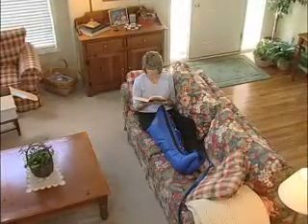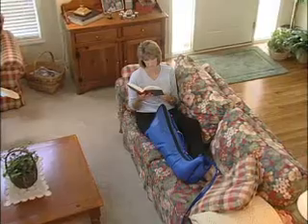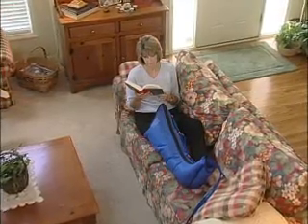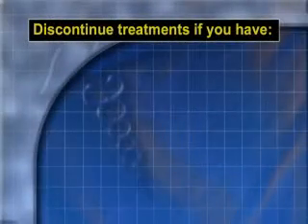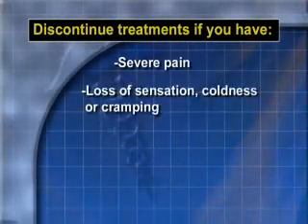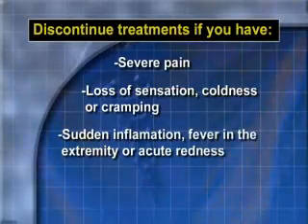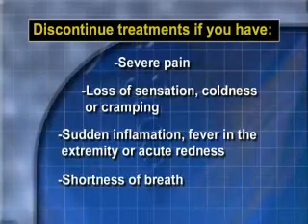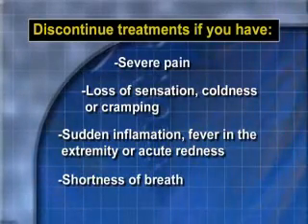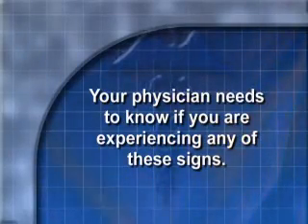As with any medical treatment, symptoms may arise that would warrant the attention of your physician. If you should experience any of the following symptoms, discontinue the use of the system and contact your physician. Severe pain, loss of sensation, coldness or cramping, acute redness with sudden inflammation and fever in the extremity, shortness of breath. Any of these symptoms could be a complication of your condition, and you should contact your physician immediately.